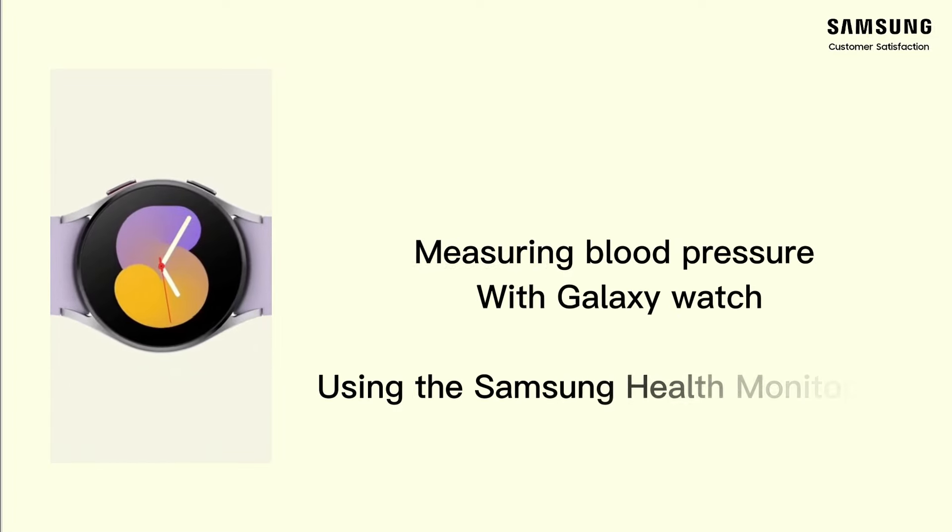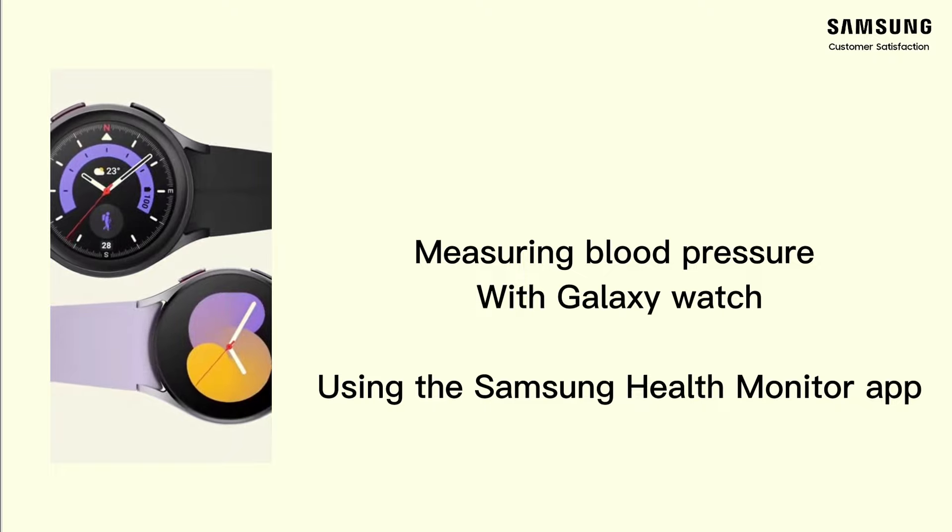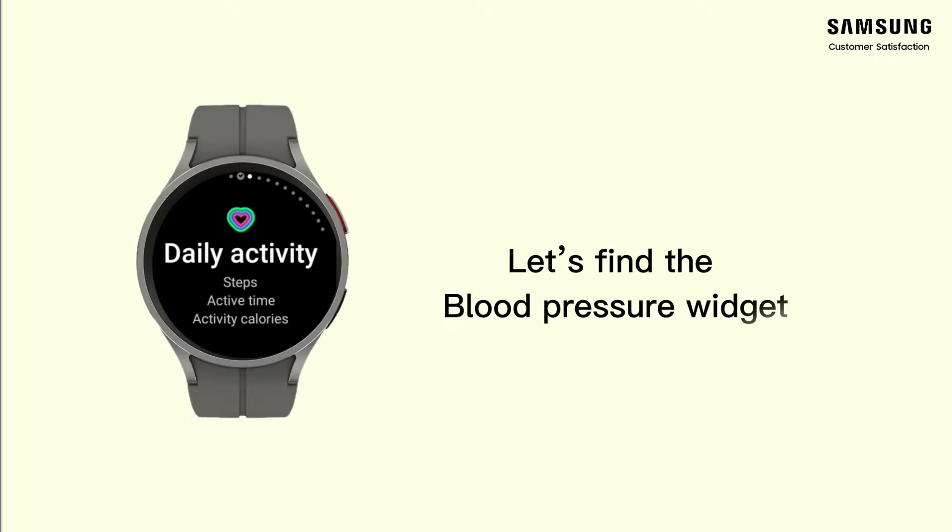Measuring blood pressure with Galaxy Watch using the Samsung Health Monitor app. Let's find the blood pressure widget.